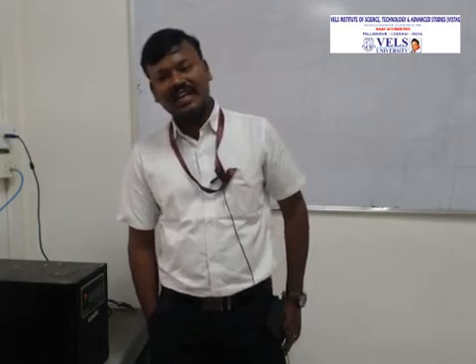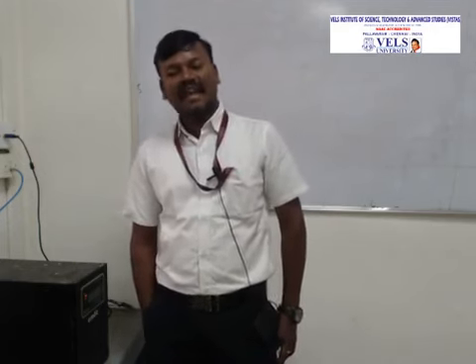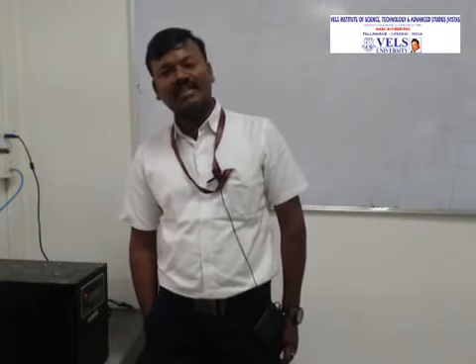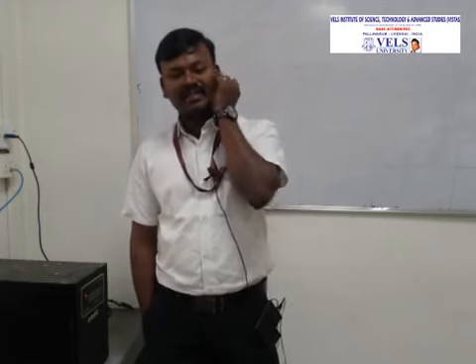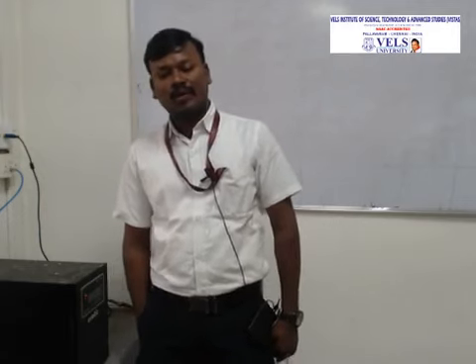This is a specifically designed laser system, which includes the laser serving as an energy source to create an opening or gap in the zona pellucida, and a computer which allows the operator to precisely control the laser energy output, laser pulse duration and gap size. It takes less time and does not expose the embryos to potentially adverse chemicals, because this procedure is quick, precise and chemical free.